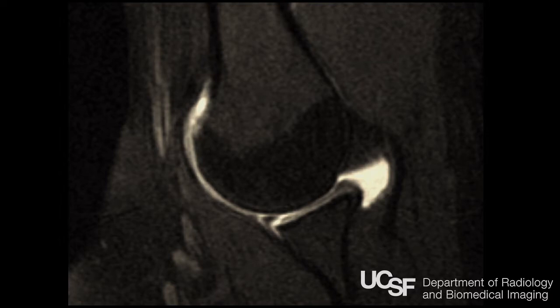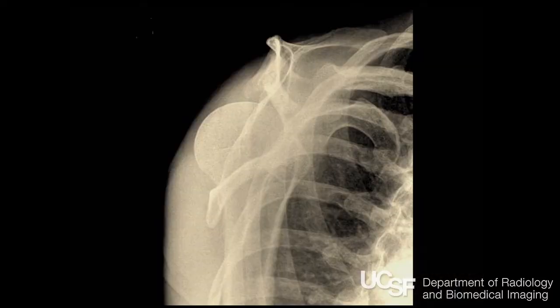This is an example of a labral tear called a Bankart tear, where the labrum is completely detached from the bone. This is an abduction external rotation view, and when you do these views, this is one of the views of the shoulder you want to do at the end of the exam because it's painful. If you do this first, you won't get any more images. So do this at the very end of the exam. It can be very uncomfortable.